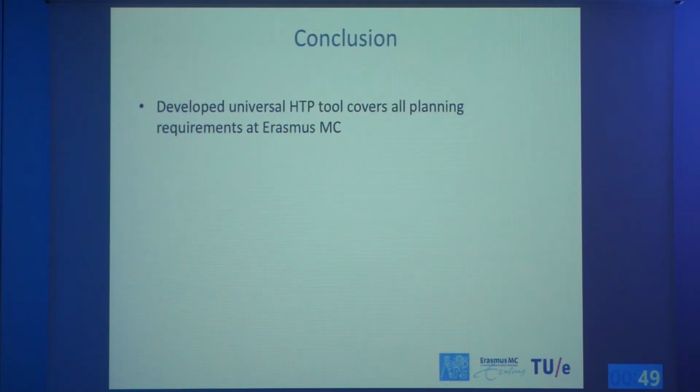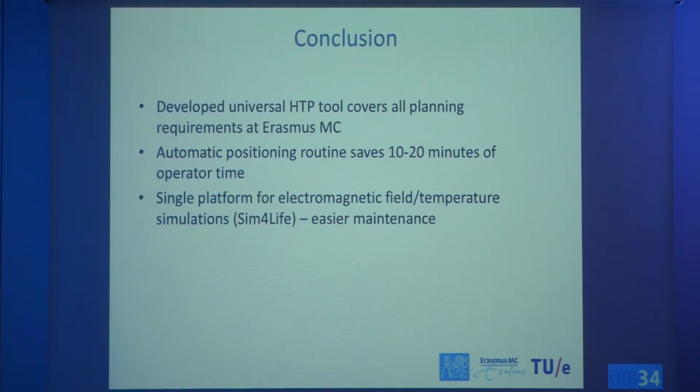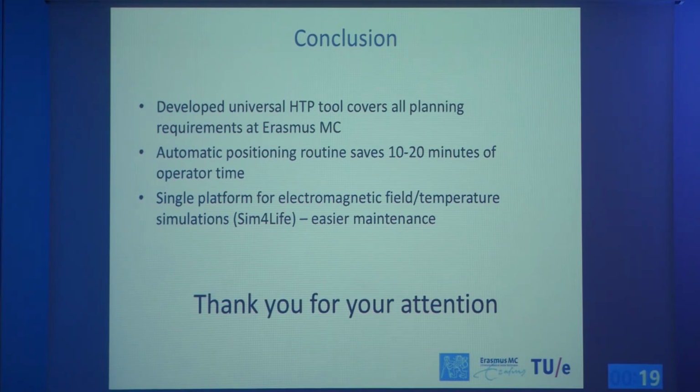To conclude my talk, we successfully developed a universal tool which covers all the treatment planning requirements at Erasmus Medical Center. The automatic positioning, which follows the manual clinical routine, saves 10 to 20 minutes of the operator time. And by joining all our simulation requirements into a single routine, we will have easier maintenance, so we don't need to do QA for 2 different software packages. With this, I would like to thank you for your attention.